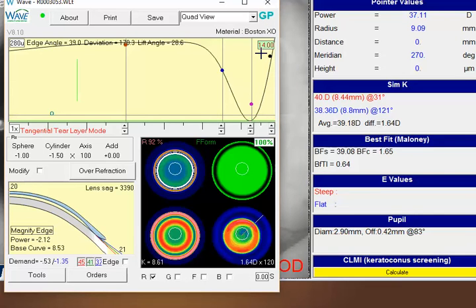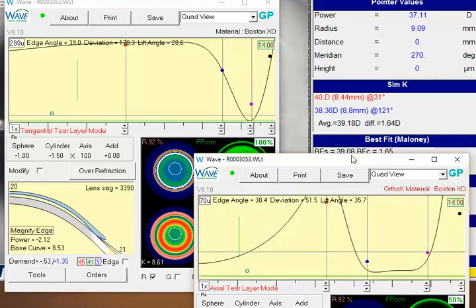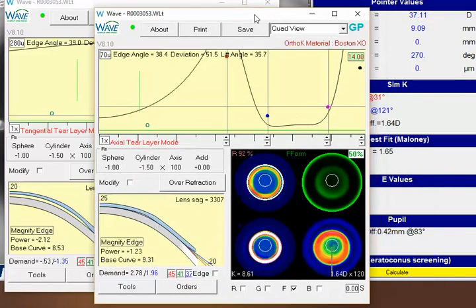If you use the Wave 8-point fitting protocol, and I attached an email with a nice tutorial on that, if you follow that protocol, you'll find that you can get a reverse geometry looking lens that does fit at about 14 millimeters, and a lot of these lenses tend to be very, very comfortable.